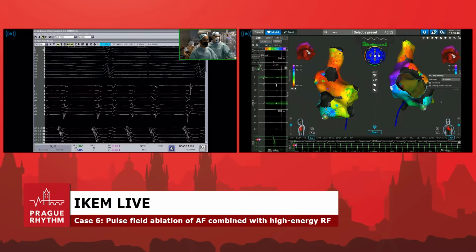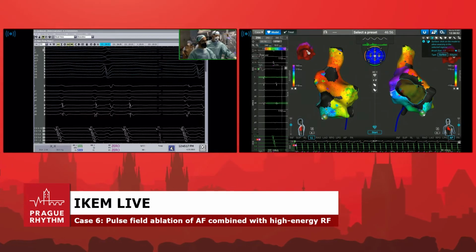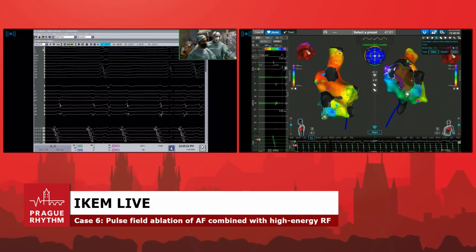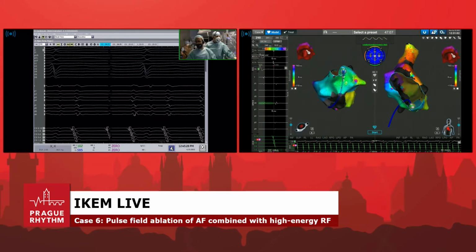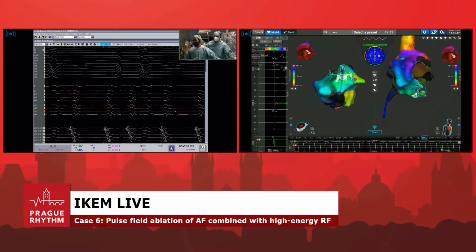Can we cut out the annulus like this? We will see now. The ablation of the cavo-tricuspid isthmus is much larger. Voita, can you show us two views for the CTI line? So we would be happy if you can see it clockwise, yes, also our eyes. That's what we said. I said clockwise.